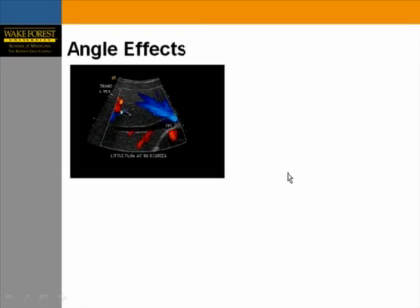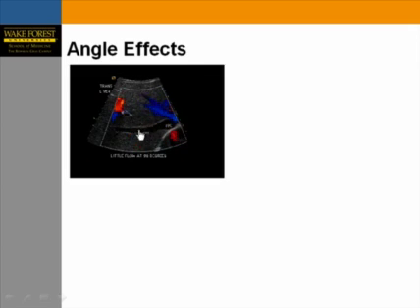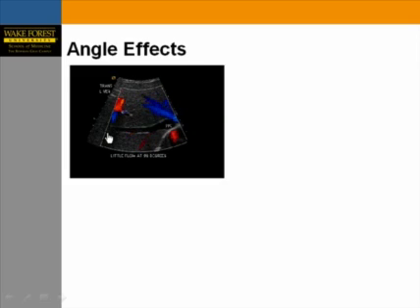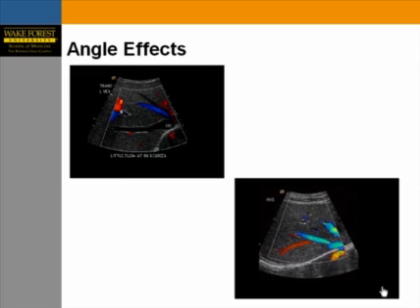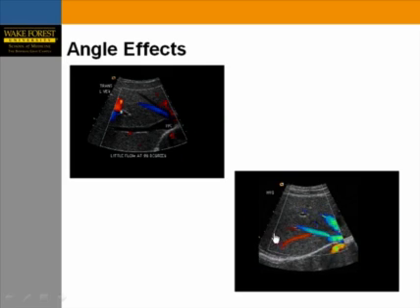Looking at this slide, the hepatic veins are nicely identified by color Doppler, particularly the middle and left. The right hepatic vein shows no blood flow — but don't jump to the conclusion there is a clot. First, change your angle. Changing the acoustic window reveals a nicely filling right hepatic vein with no evidence of clot or abnormality.